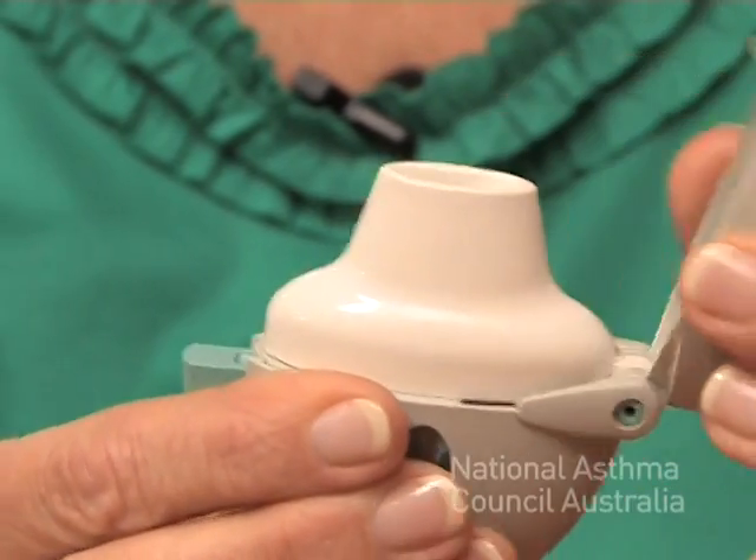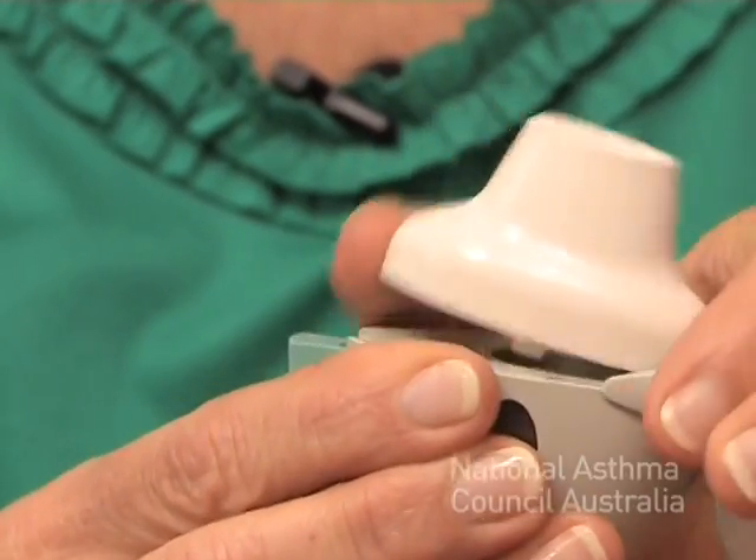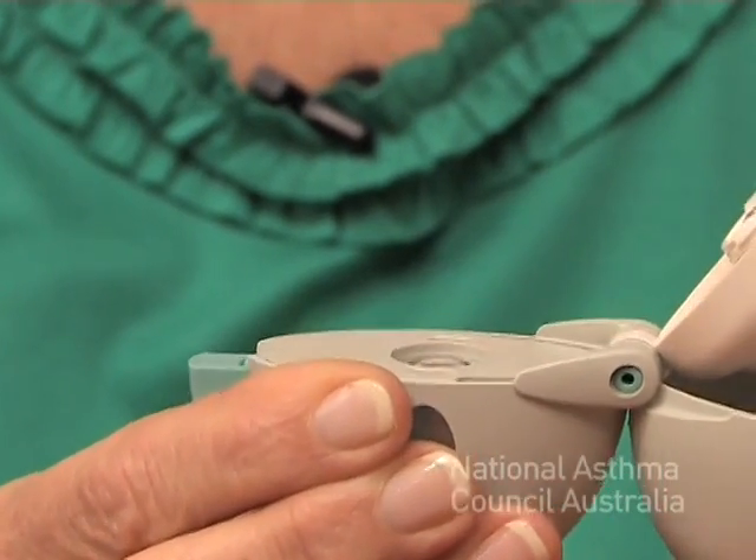Jeff, I'd like to show you a handi-haler. A handi-haler is a device that's used in conjunction with a capsule that has the medication in it. There's a dust cap on the top, a mouthpiece, and then the main body of the device.